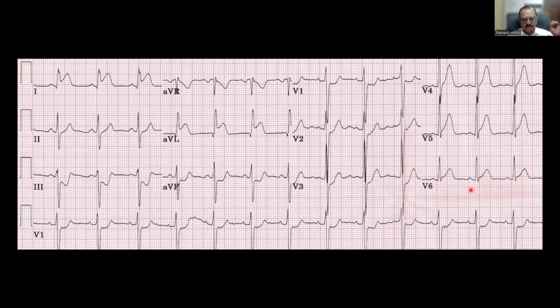Concentrate here. Is there ST elevation? Yes, very good. Very significant ST elevation. It is staring at you. Nobody should miss this ST elevation. Everybody got it? Yes, sir. Significant ST elevation. What is it?